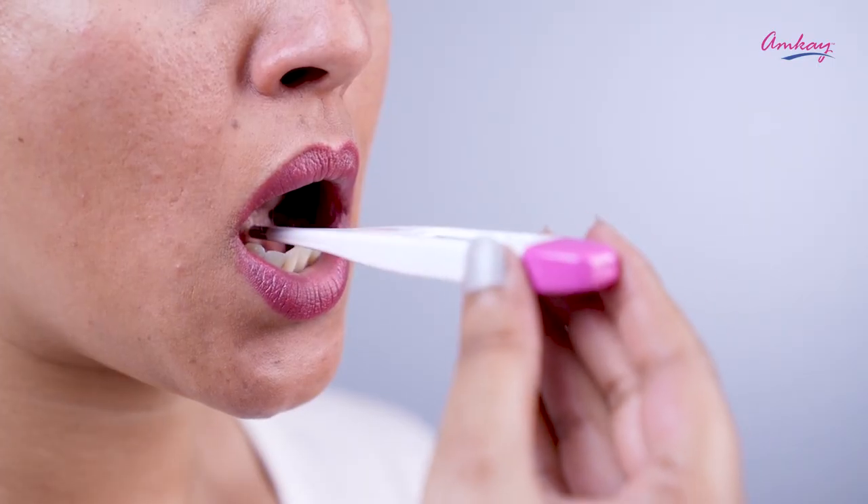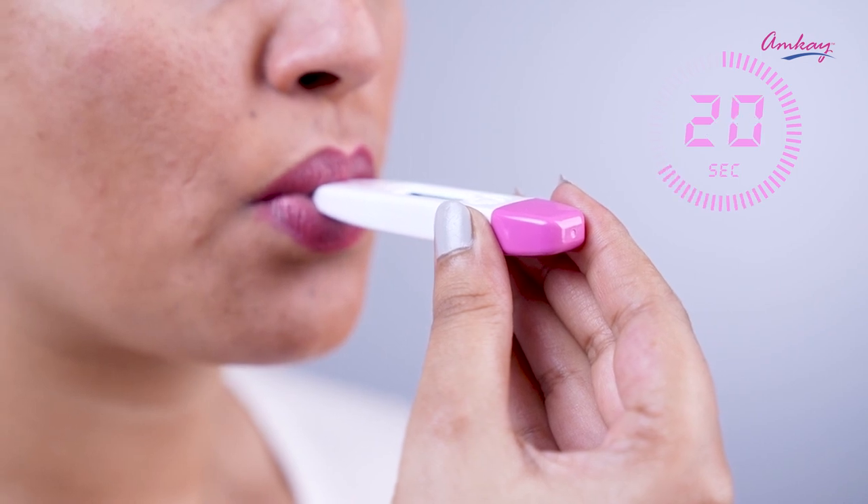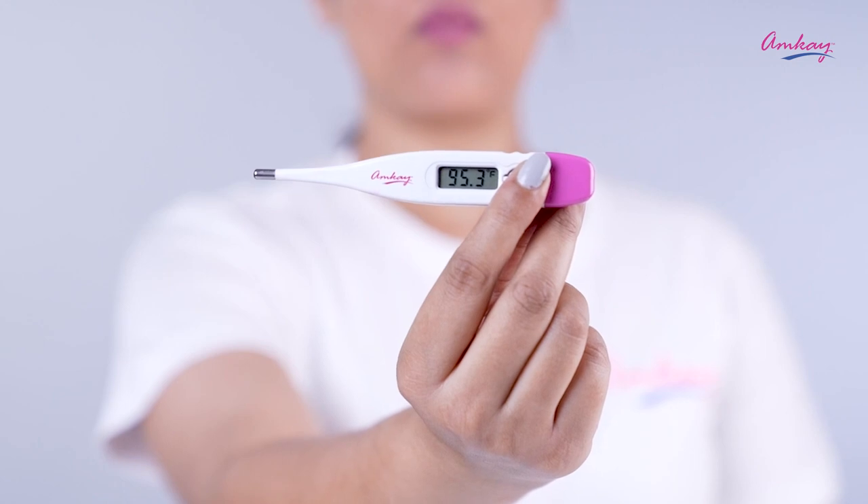Now let's see how to use this thermometer. First of all, press the power button to turn it on. Keep it in your mouth or under your arms for about one minute, read the temperature, and it's done.